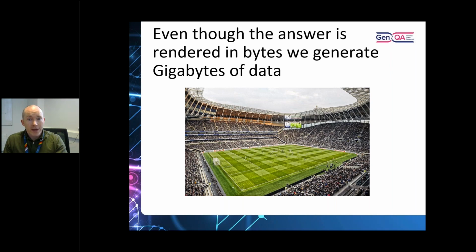But really, that's kind of the way NGS works. If you look at this stadium, maybe there's 50,000 people in there, you could be looking at a data problem that's 100 times that. So imagine a stadium 100 times bigger. You can only measure hair color as your output. It's inaccurate, and you generate this massive file, and you have to try and figure out from that who's in the wrong seat. And that's pretty much what we do with next-gen sequencing.